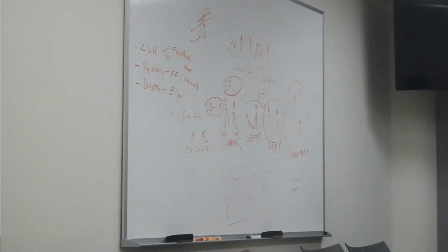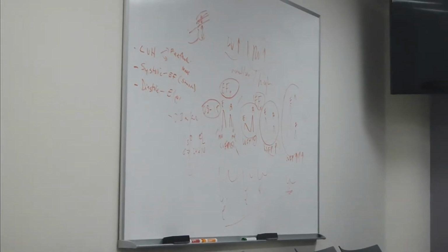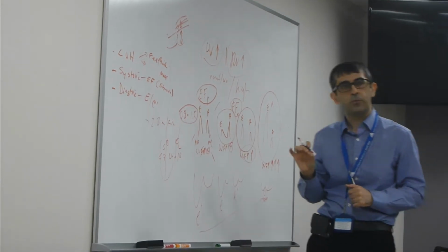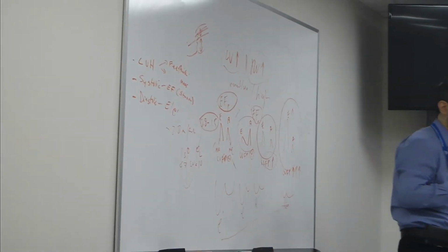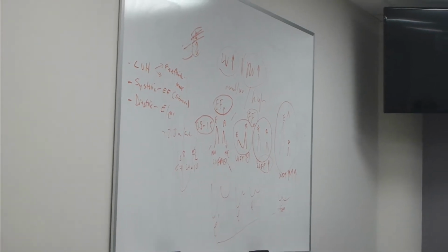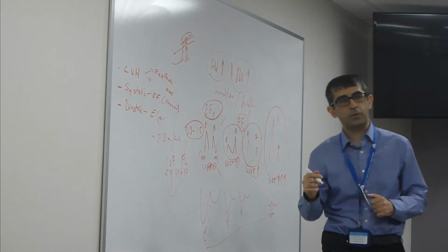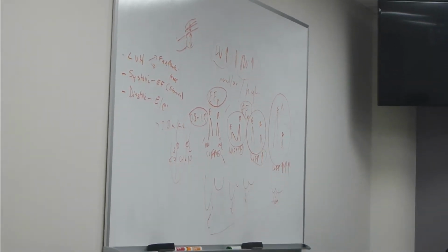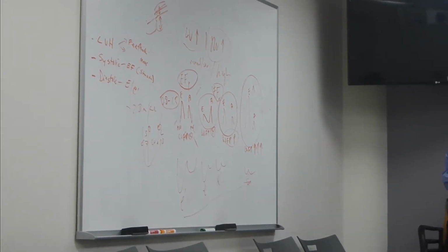The problem here is that measuring TR velocity, you have to measure at multiple points in multiple views and get the highest velocity, which I don't know how feasible it is in the emergency room, because even the techs sometimes struggle to get the best view, RV inflow, subcostal, 4-chamber, to get the highest TR velocity and make sure that you're not underestimating the pulmonary pressures, right?